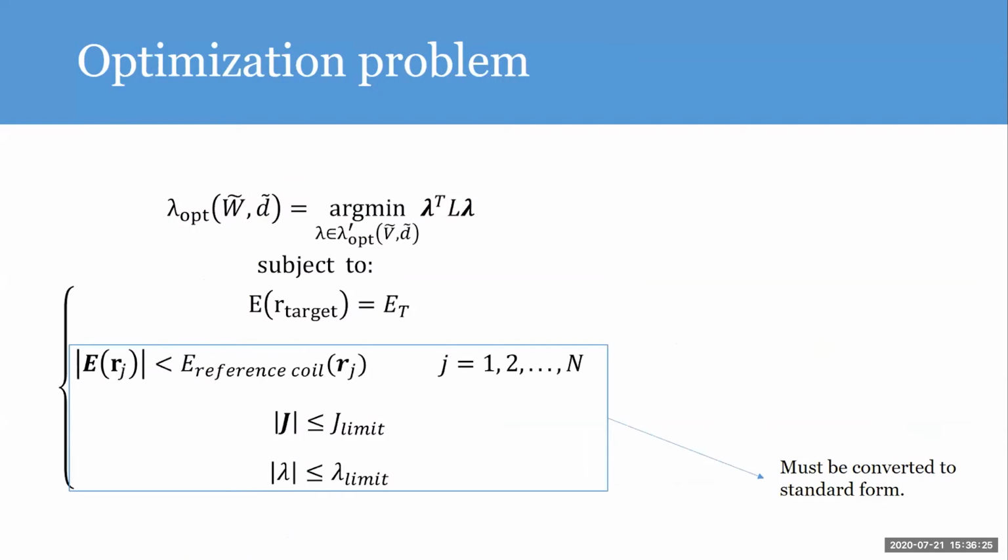And for that problem, we needed optimization that produces reasonable coils. We want to have coils where we can limit the current density explicitly in the coil so that we get windings that are not too dense anywhere. And we want to limit the minimum feature size, which we actually can limit by limiting the stream function values in the absolute scale so that we don't have too small a loop, because small loops do displace more than large loops. And those were something we found with the structural model.